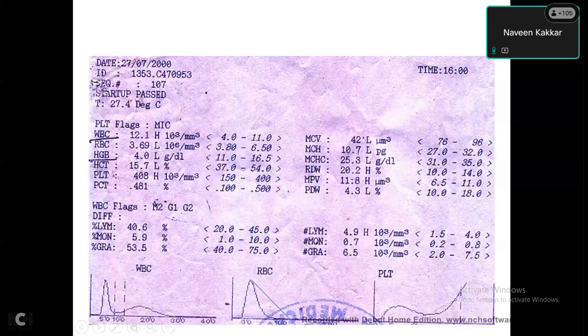So this is a case to begin with. Hemoglobin is 4. Indices are very low. It's a microcytic hypochromic picture. RDW is high. So as you will know, this is a classical case of iron deficiency anemia with this picture. Why not a thalassemia? The anemia is very severe. The RDW is not that high. Thalassemia will take you usually beyond 25, even in 30s. So this seems like a very severe iron deficiency anemia.